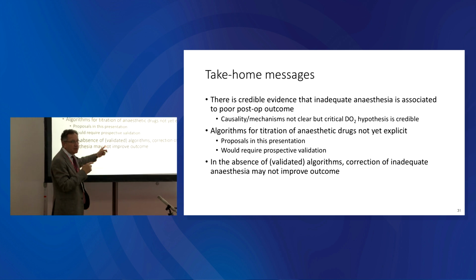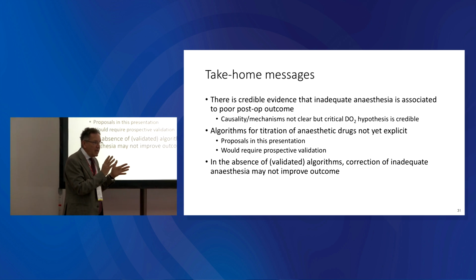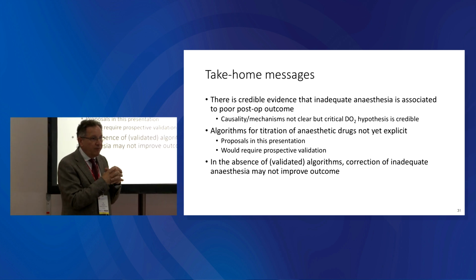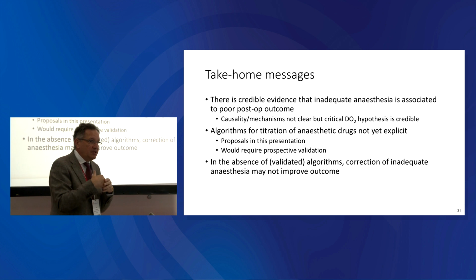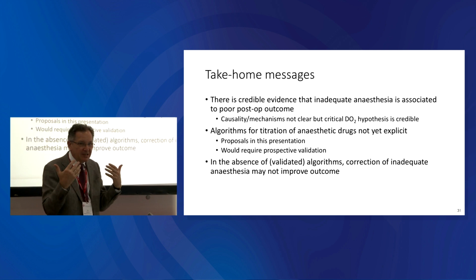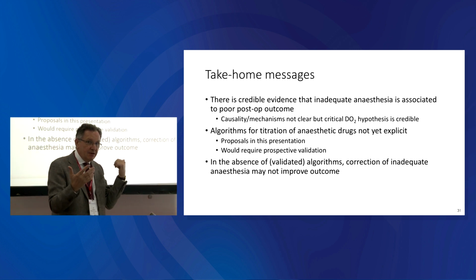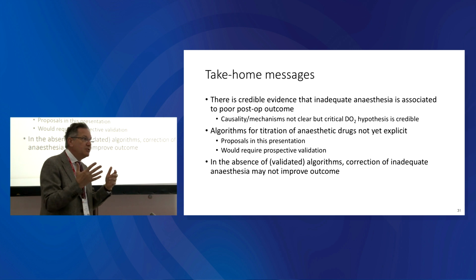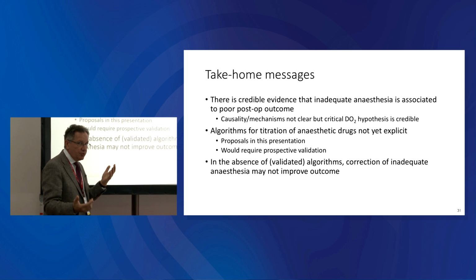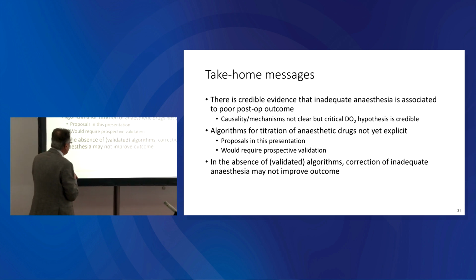too deep anesthesia, which should actually be a motivation for you and for us in general to look differently at anesthesia, because before the data on the association between too deep anesthesia and poor outcome came, what we were told is that the presentations we were doing were nice for academics, but you as a frontline anesthesiologist could do without it, and you do it every day, okay? The problem is that with thousands and thousands of patients in the databases, now the association, not causality, is there repeatedly. So we should require from ourselves a change in the way we look at anesthesia.